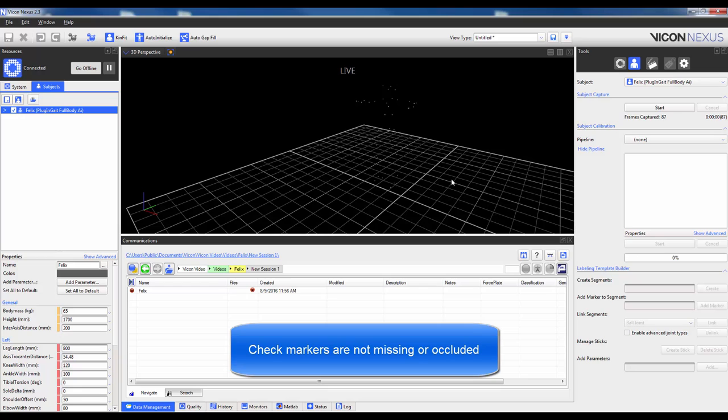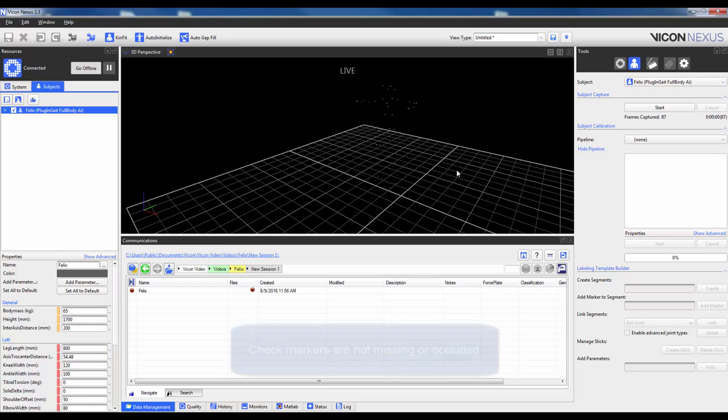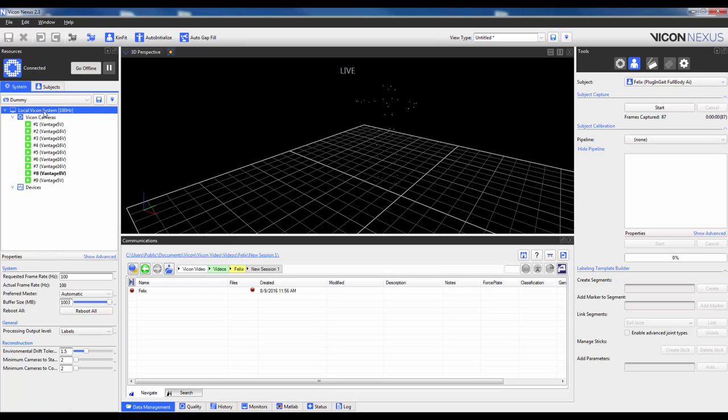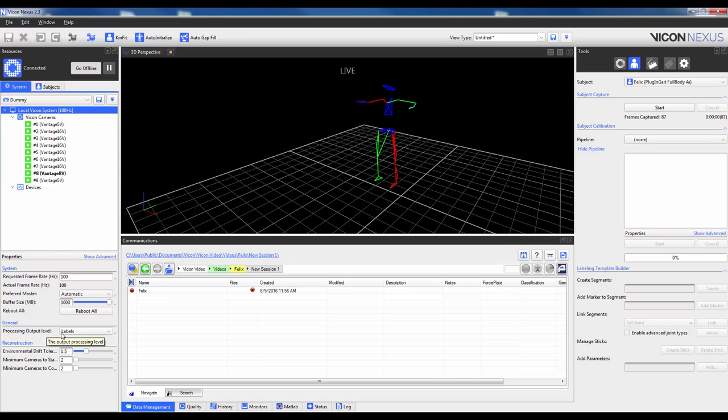If they are not, make sure you have actually placed them on the subject or that the subject is not occluding them. Sometimes the software will try to label the subject by using the existing template. If this makes it difficult to see the markers, navigate to the System tab, click on Local Vicon System, navigate down to Processing Output Level and change Labels to Reconstructions. Just make sure to change it back for the Dynamic Trials if you wish to see real-time labeling. This is something I will do later in the video.